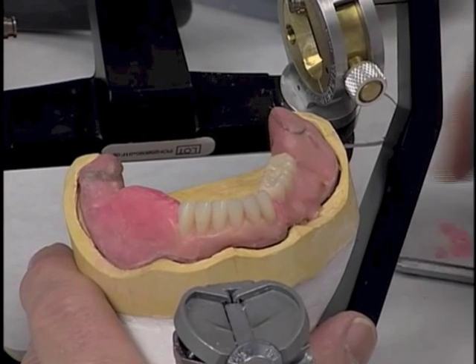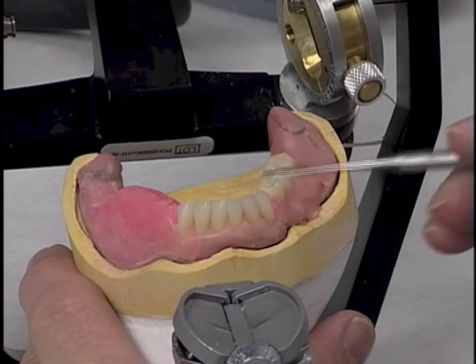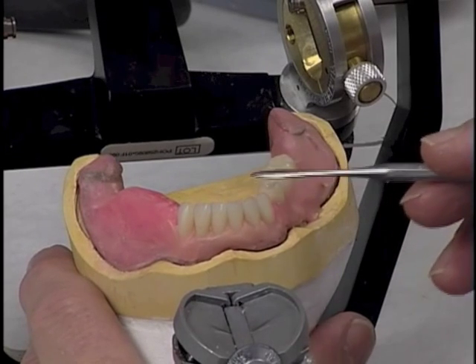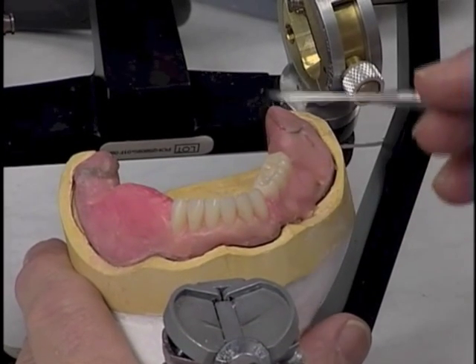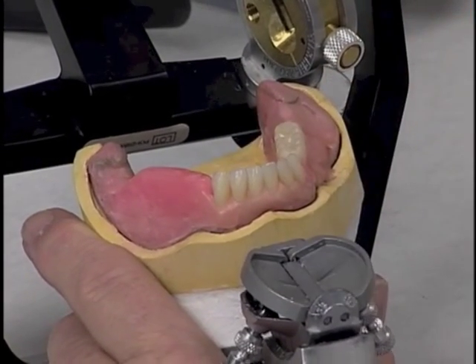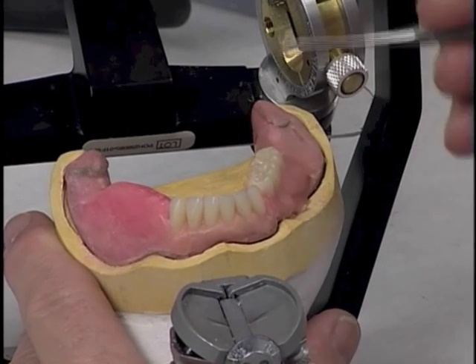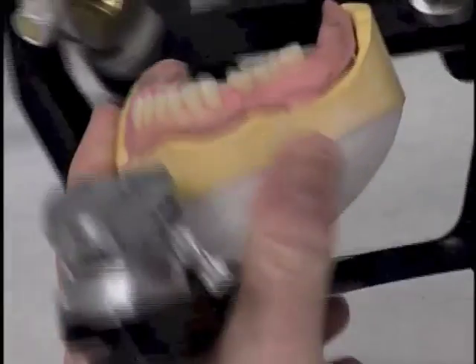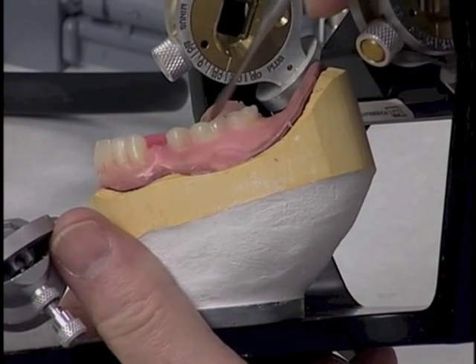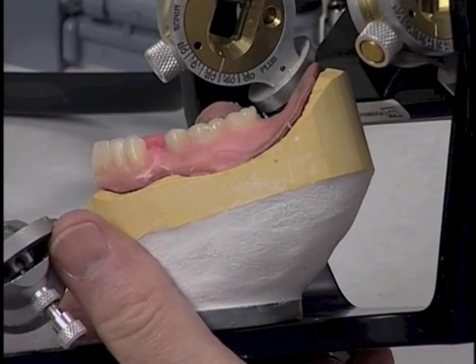Remember now, the compensating curvature, which is what we're dealing with, is a combination of the curve of von Spee, or as we Americanized it and called it, the curve of Spee, which is an anterior-posterior curve, and the curve of Wilson, which is a lateral to medial curve. And that means that the lingual cusp of these posteriors, through the molars in particular, will be slightly depressed from the buccal cusp. And when we look at it from a lateral view, we have a curvature of all the buccal cusp tips. Should be a nice even curvature from the canine tip through the distal of the second molar.